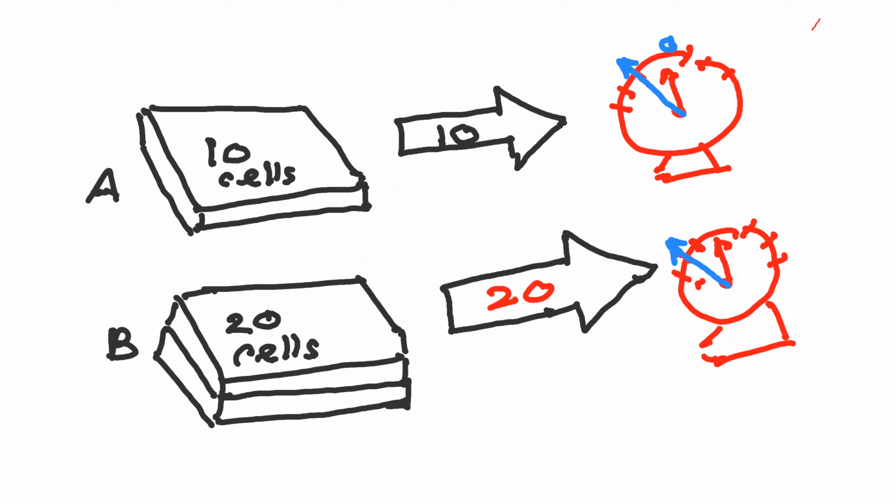Now here you have to understand the force. How can we interpret force in the galvanometer? If the numbers go higher, the force in the galvanometer is higher. So what happens if I add 3 cell layers to this picture? If I add 3 layers, now what happens? The galvanometer reading goes higher than 20, could be 30. If I increase the cell layers, that means the force goes high.